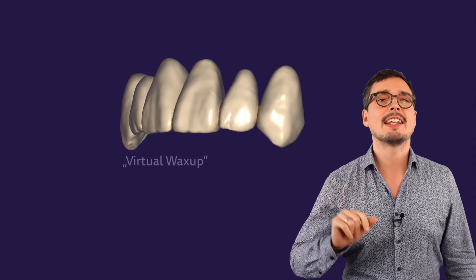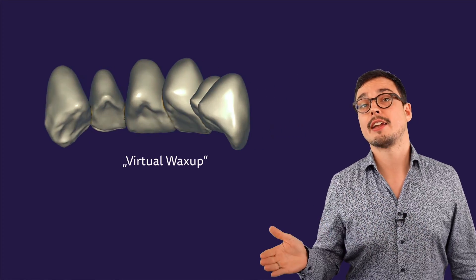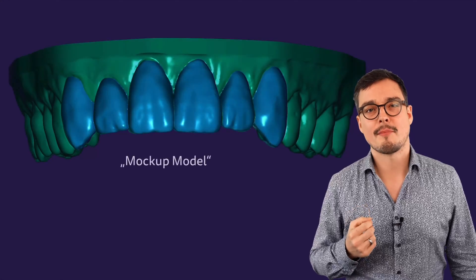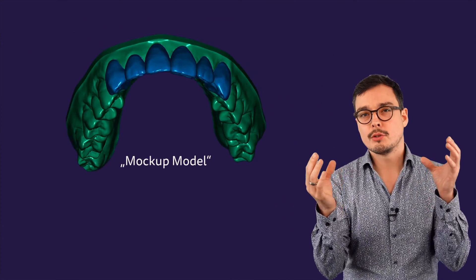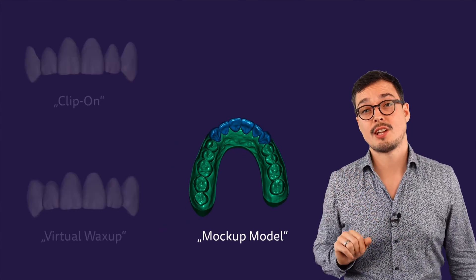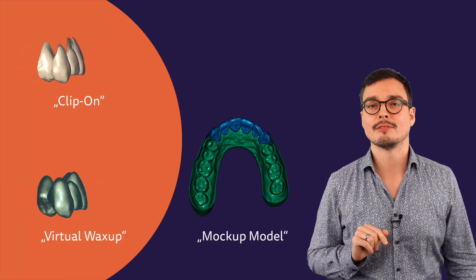Second, designing a virtual wax-up to create a design in advance for handling complex cases later. Third, a mockup model — we merge the digital design and the original model into just one watertight mesh. The first two options I will show you now, and in a separate video tutorial you can see the mockup model later.